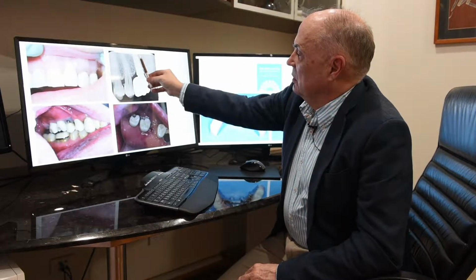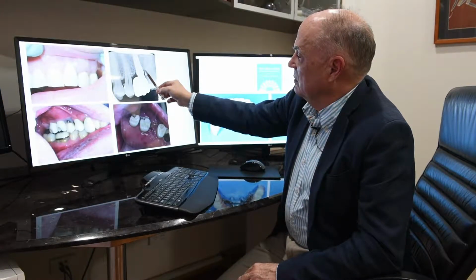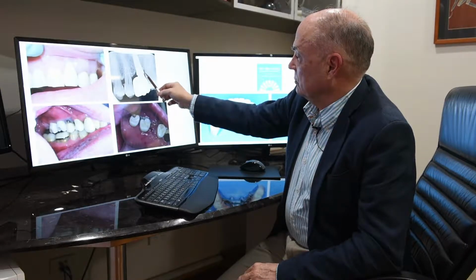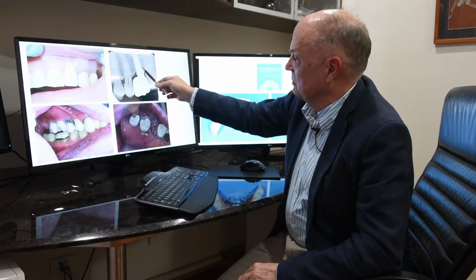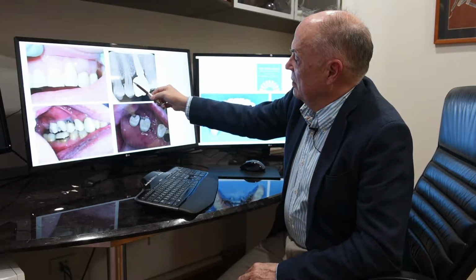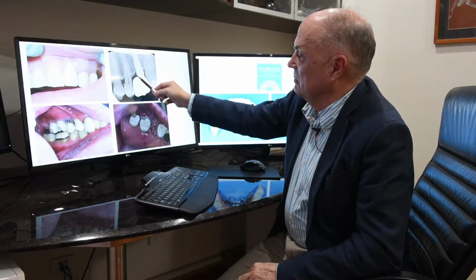This one here, we're too close to the tooth. And again, there's no space between the tooth and the implant. This is an exceptionally hard place to clean. And if there's something wrong with this tooth and this tooth is extracted, there's a good chance when the tooth is removed there'll be significant damage to the implant, and this implant will be lost. And also this overhanging here, because it's not centered, will collect plaque, and it's very hard to floss and clean underneath this ridge lap or overhanging design.